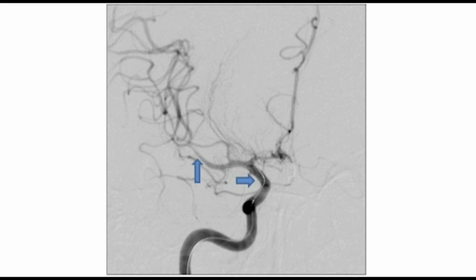This is a right internal carotid artery angiogram performed after balloon angioplasty of the right middle cerebral artery and distal internal carotid artery. Note the further increase in the caliber of the vasculature.